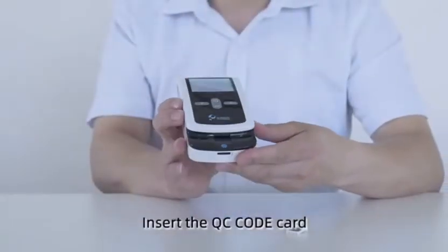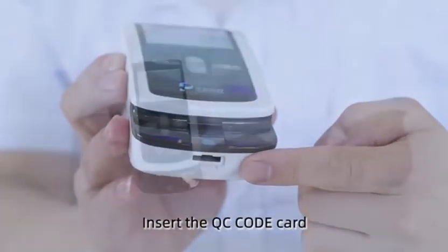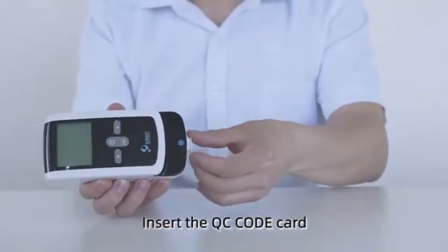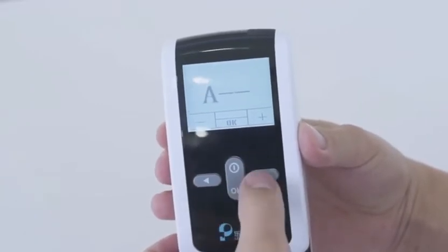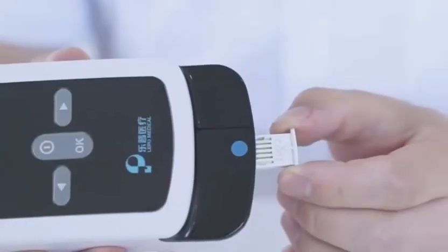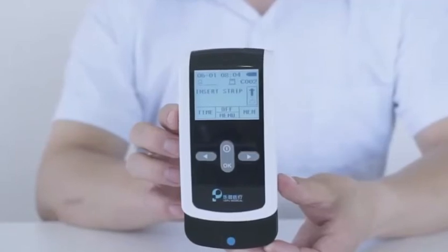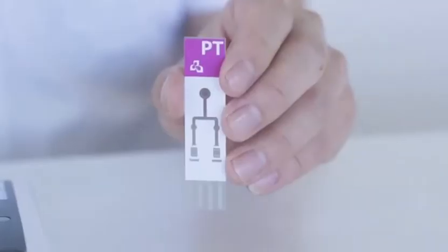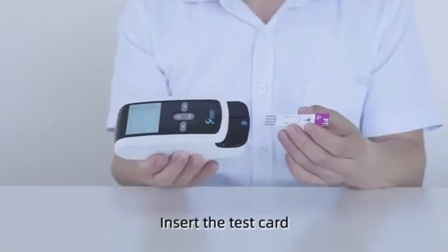Insert the QC code card. Insert the test card.